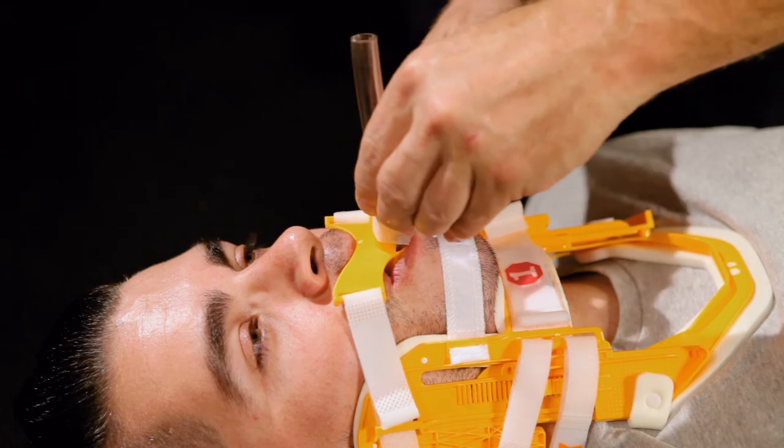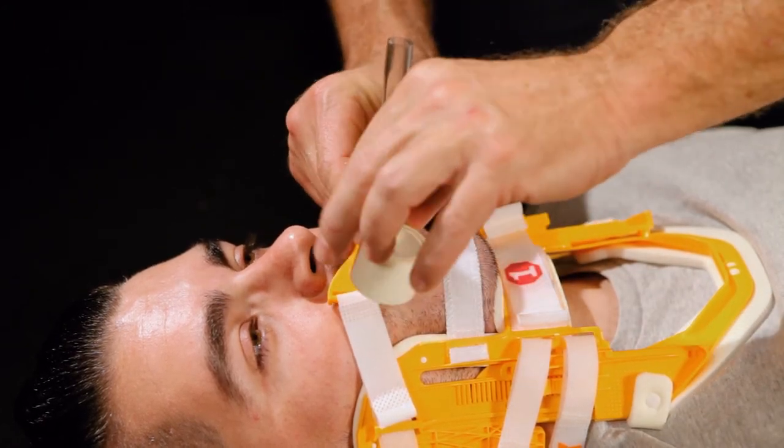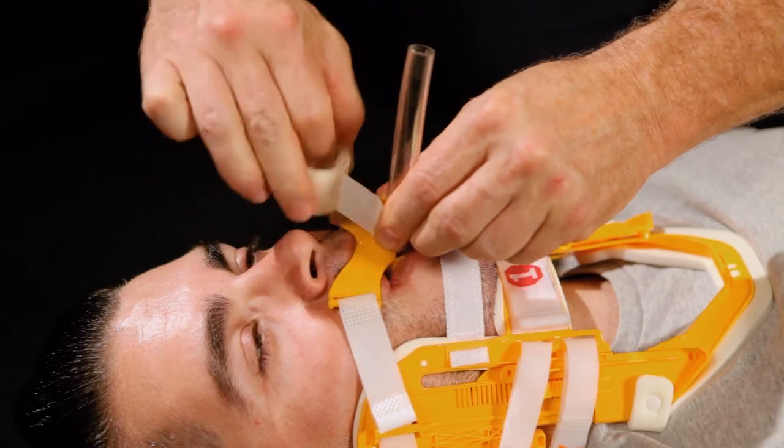Pinch the tube holder around the ET tube and wrap adhesive tape around the tube holder, working your way up to the ET tube.